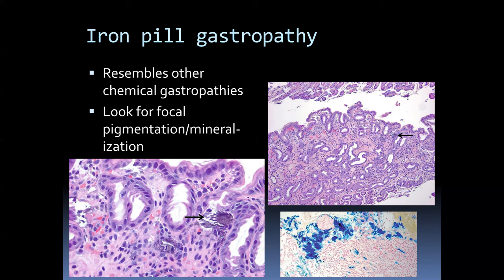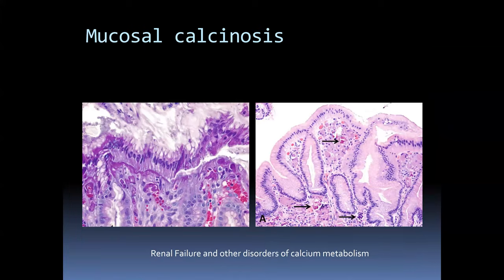Iron therapy is fairly widely employed and can produce a gastropathy similar to those already mentioned. What we look for is areas of mineralization — an early clue on H&E — and using the Prussian blue reaction (iron stain) you see dramatic blue-positive material representing iron. Other mineral disorders include mucosal calcinosis, seen on H&E and PAS, in patients with renal failure or calcium metabolism disorders such as parathyroid disease.